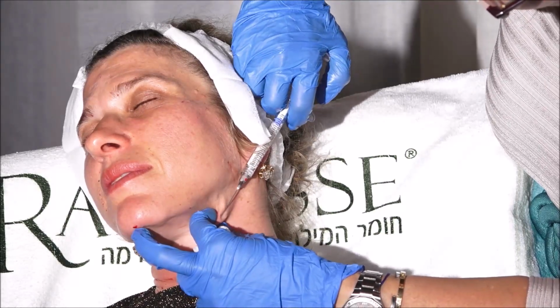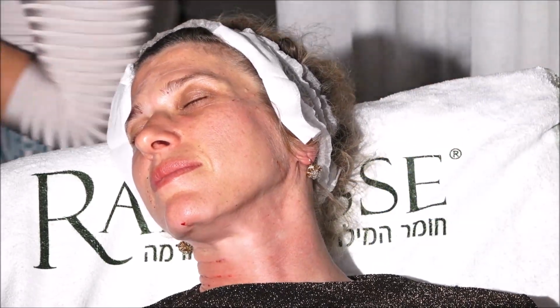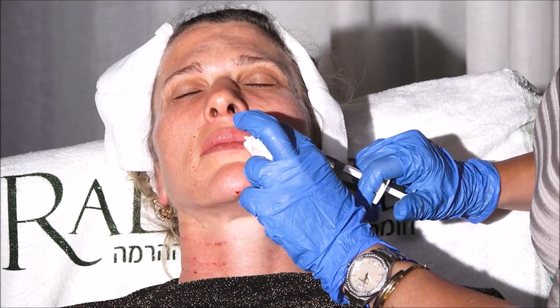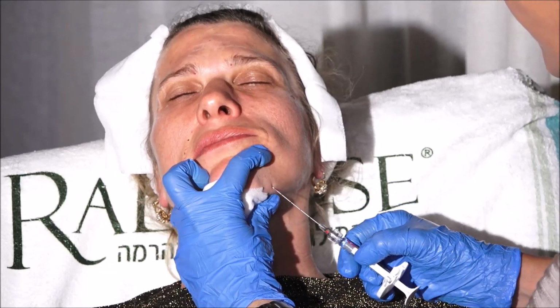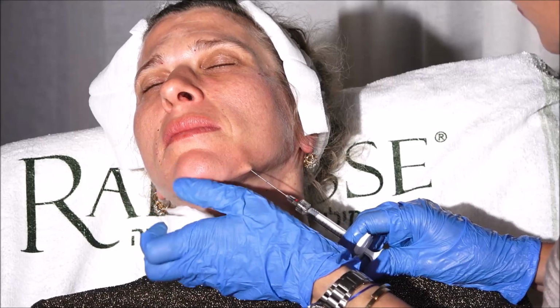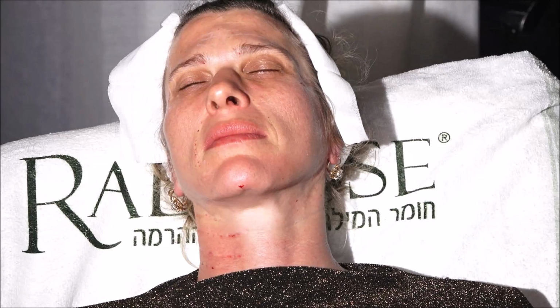Felt it. What do you need now? Okay. Let's do the Belotero for her. Balance. Yes.